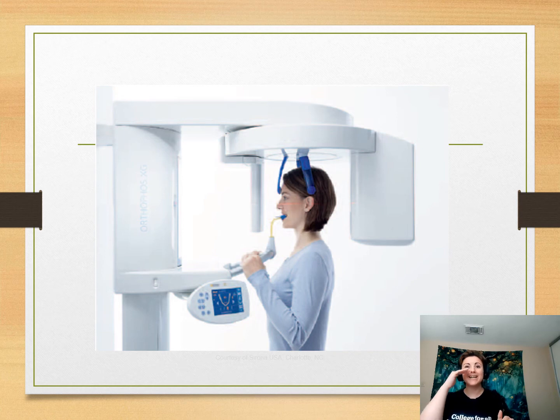You can see too, she has that little line going across. That is something we're going to talk about in the next couple of slides. It's called the Frankfurt plane. I don't like using the Frankfurt plane. I'll talk to you about a different plane. But for the purpose of this one, that little line shows up and it should be parallel with her across the front. That way you know she's not too far up or too far down, because that will cause us a lot of problems later on. It's important that we get our patients in there correctly so that their teeth are in the focal trough.